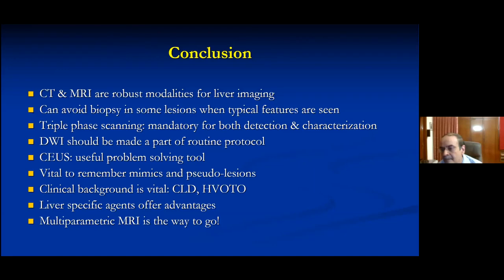One of the questions that has been asked by Dr. Subhashish from Noida is, are MR contrast agents nephrotoxic and more nephrotoxic than CT contrast agents? And in the same breath, what is your cutoff for serum creatinine levels for using multiphasic CT scan?